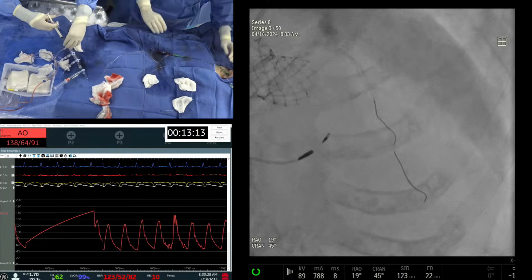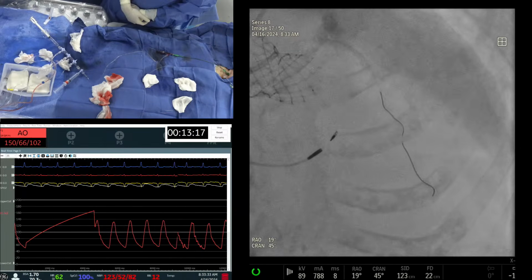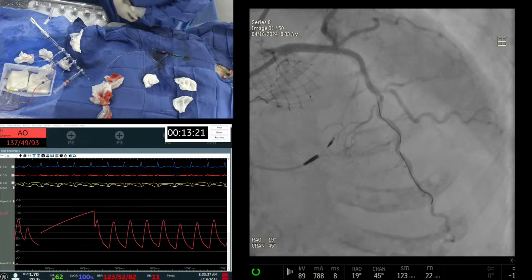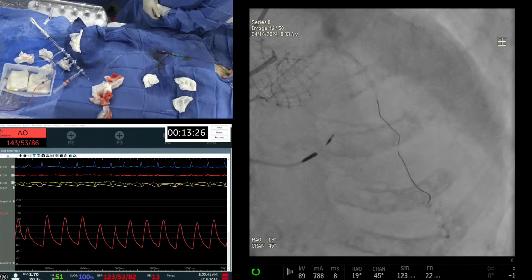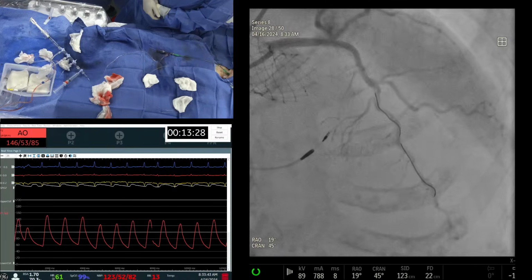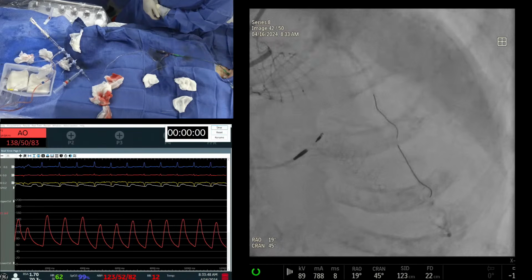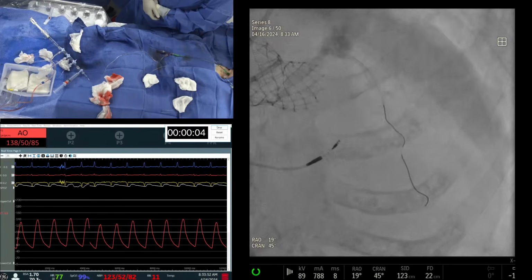You want longer? Stent-like result. Yeah. No, why? No, 12. I think we have ablated that area a little. I think you use a 16. Yeah, 16 or 20. 16. No, 16. Not Synergy 16. You see the guide is barely in the sinus. Yeah. Right. But now it's okay because once you have done the rota, now you can bring your GuideLiner or Godzilla and then do the case.